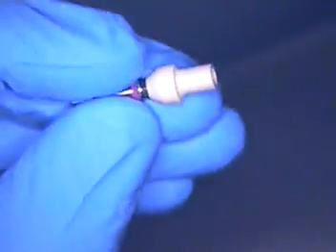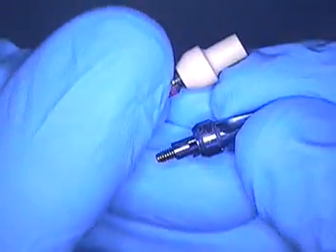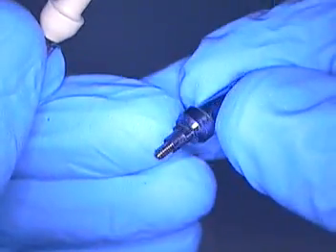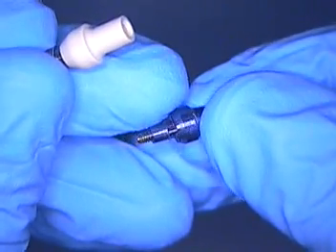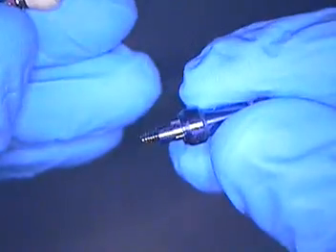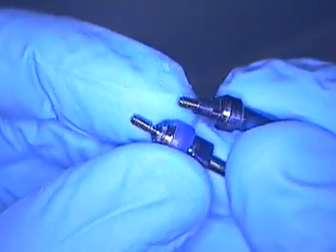Now, you can take another — whether it's a closed tray or open tray — and use the same configuration. Here's Nobel's transfer coping, and it has a lot of line angles that are very straight and very defined, with sharp line angles. By contrast, this one is soft and easier for the tissue — I like this one better. That's why I'm converting. So you go ahead and do the conversion, and you have this really nice soft taper, which is nice.